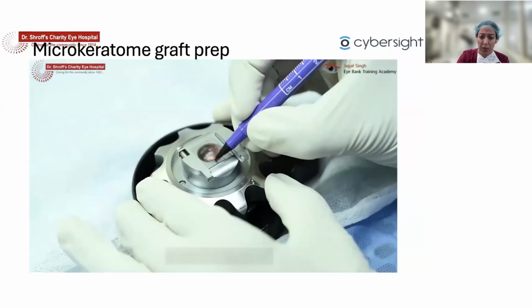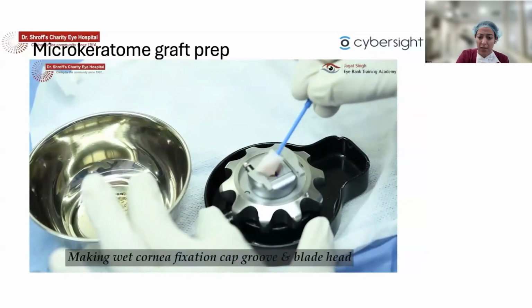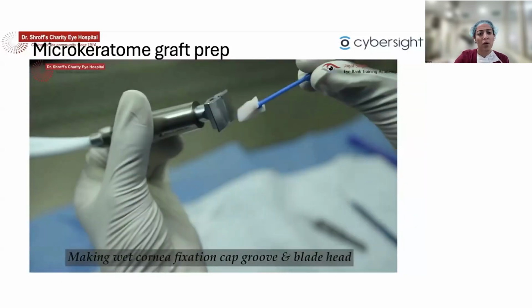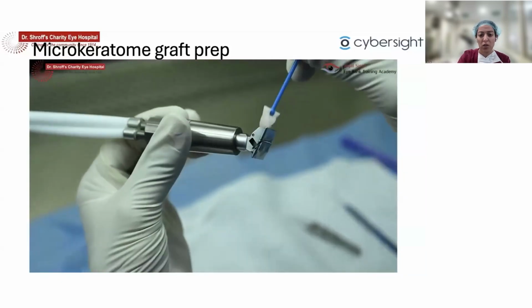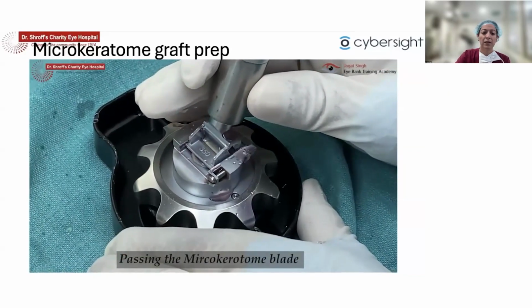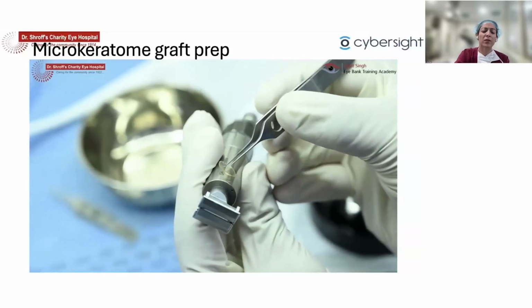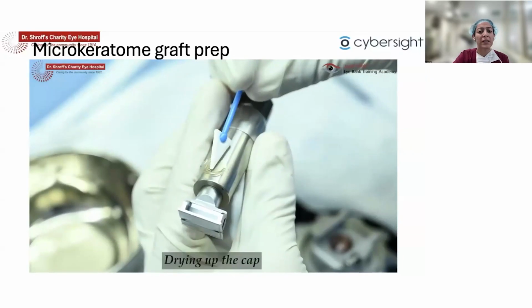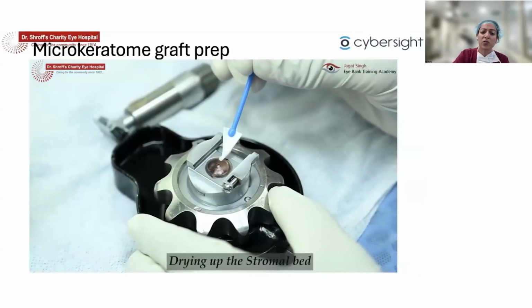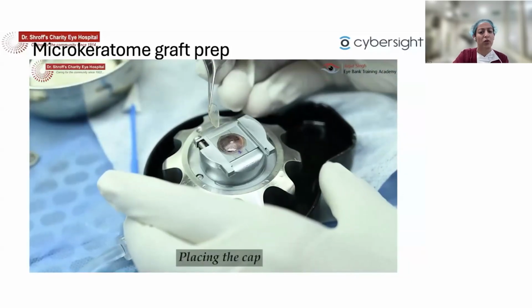We do a corneal thickness measurement, mark for a reference, and then you have to wet the hinges where the blade is going to run and the head of the microkeratome to allow an absolute smooth and an obstruction-free passage. The microkeratome blade that is usually used is about a 350 micron, and the nomogram that we usually follow is that if the corneal thickness is about 570 micron and under, we use a 300 micron blade. And if it is more than 570 microns, we usually use a 350 micron head.